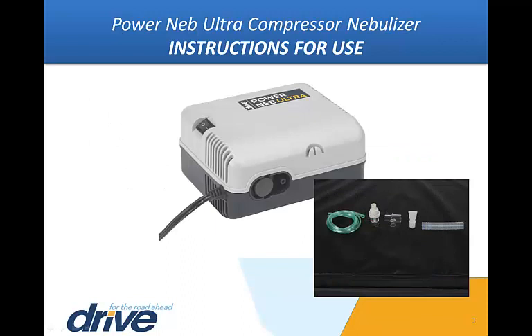Remove the PowerNeb Ultra and nebulizer cup assembly from the box. Place the nebulizer on a table or flat surface. Before each use, inspect the compressor and the nebulizer cup assembly for damage or wear.